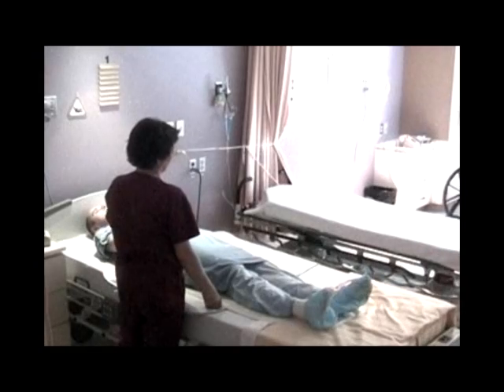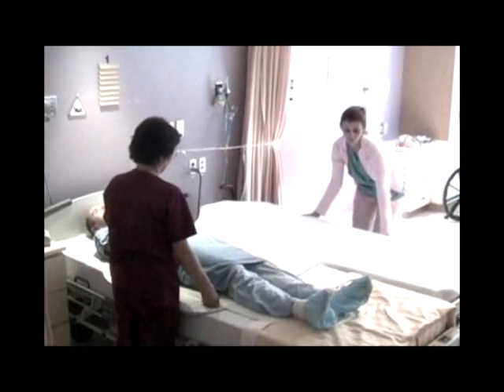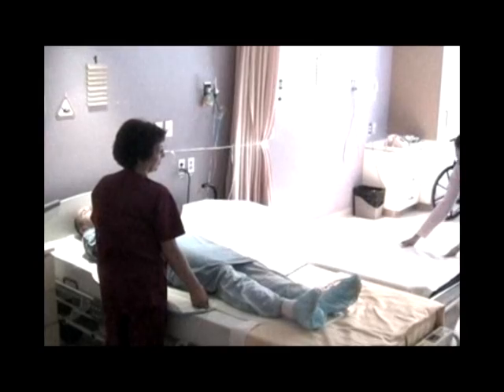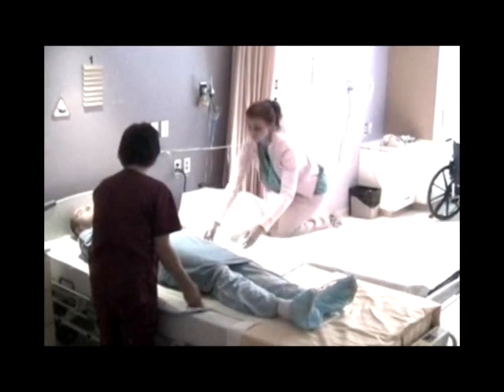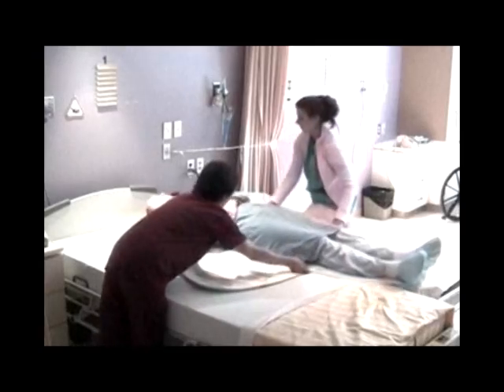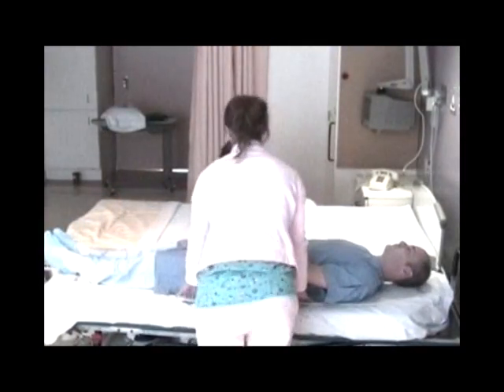Position the stretcher parallel to the bed and ensure that it is locked. The 2 caregivers stand on either side of the bed facing the patient. The leader should stand on the side to which the transfer takes place. Together count 1, 2, 3. Caregivers shift their weight from front to back or from back to front as appropriate, and slide and pull the patient smoothly onto the stretcher, maintaining good body mechanics.